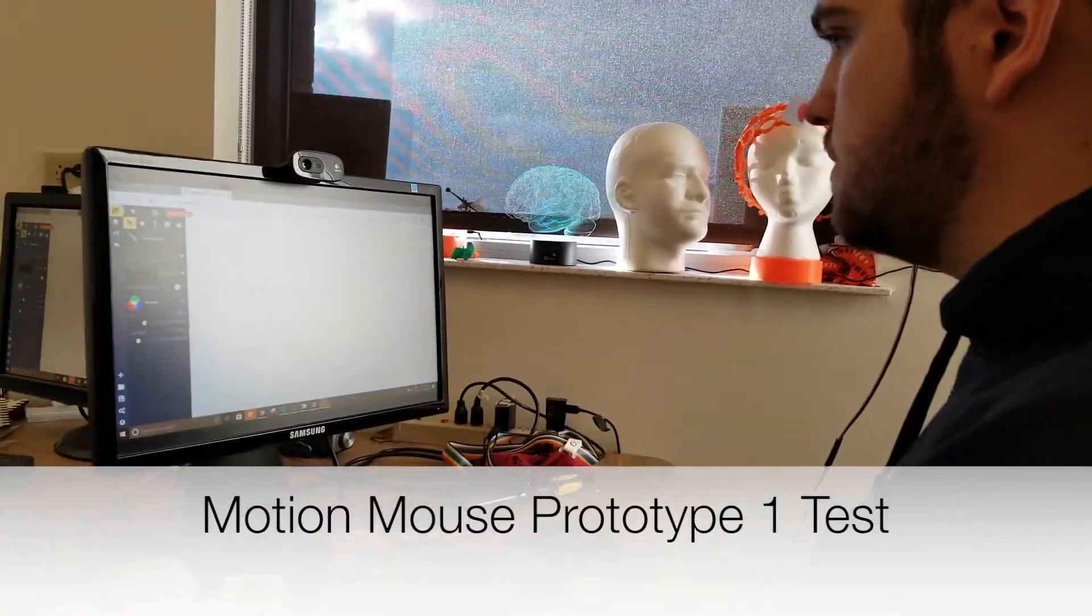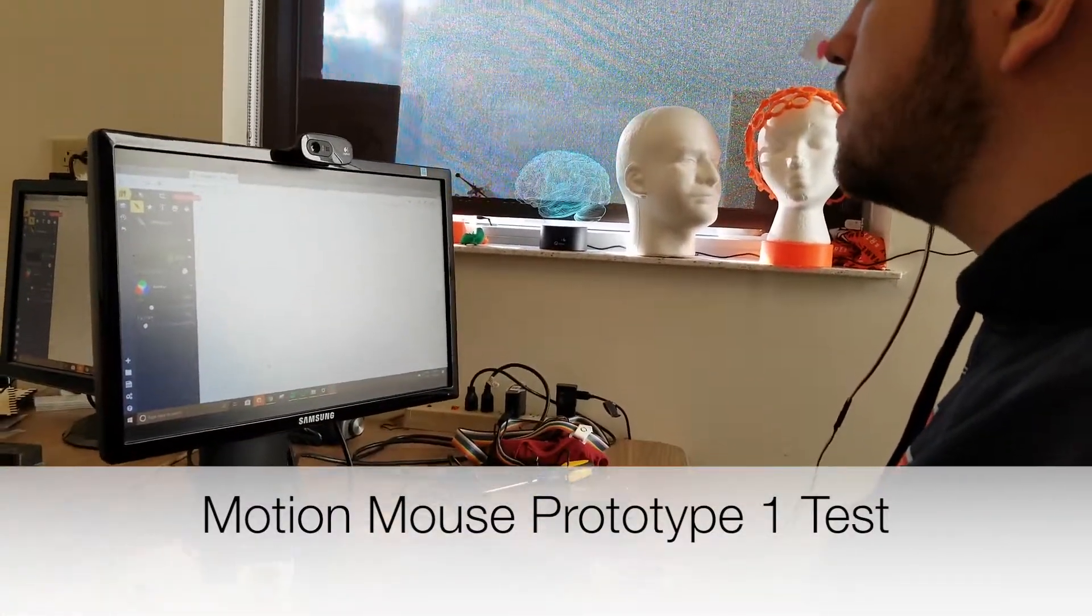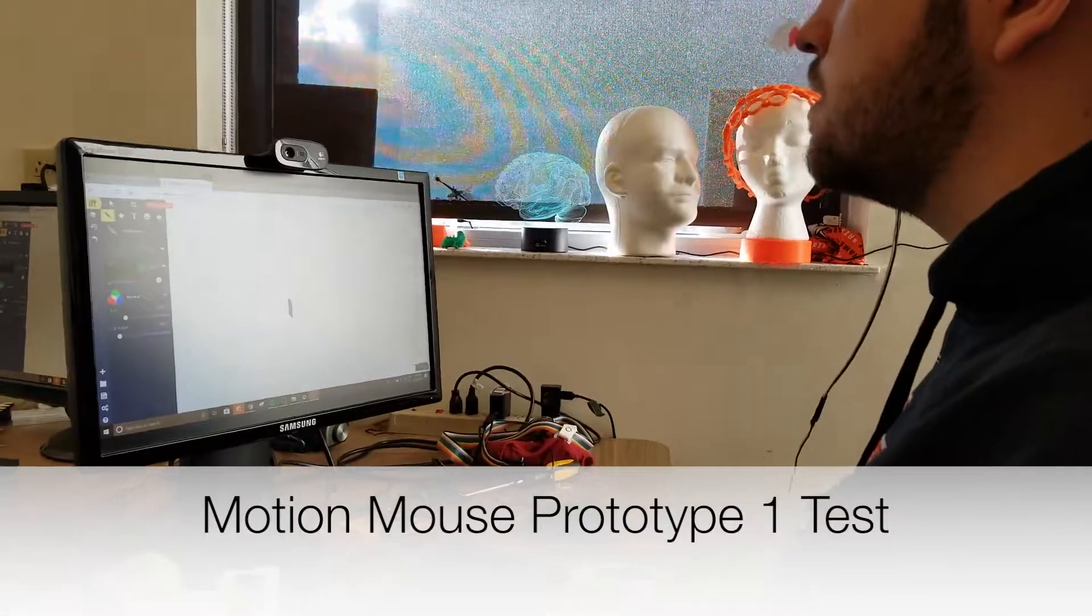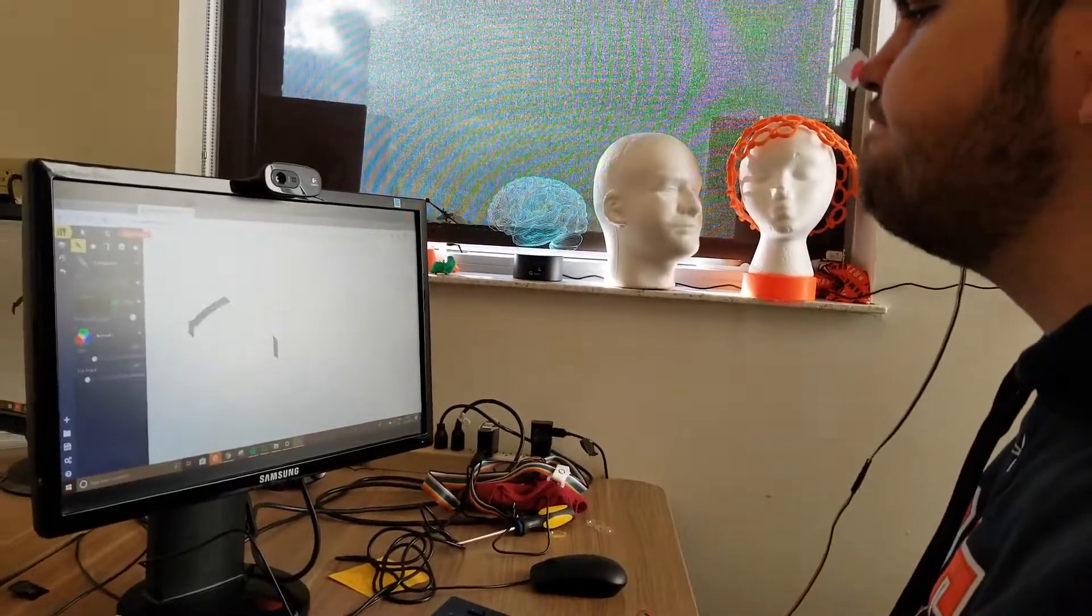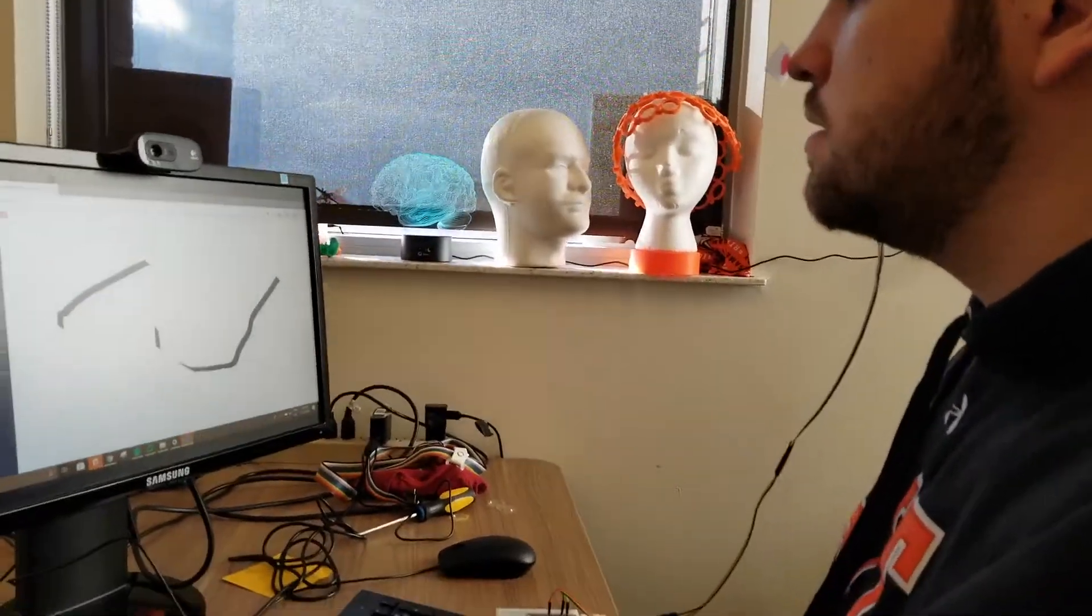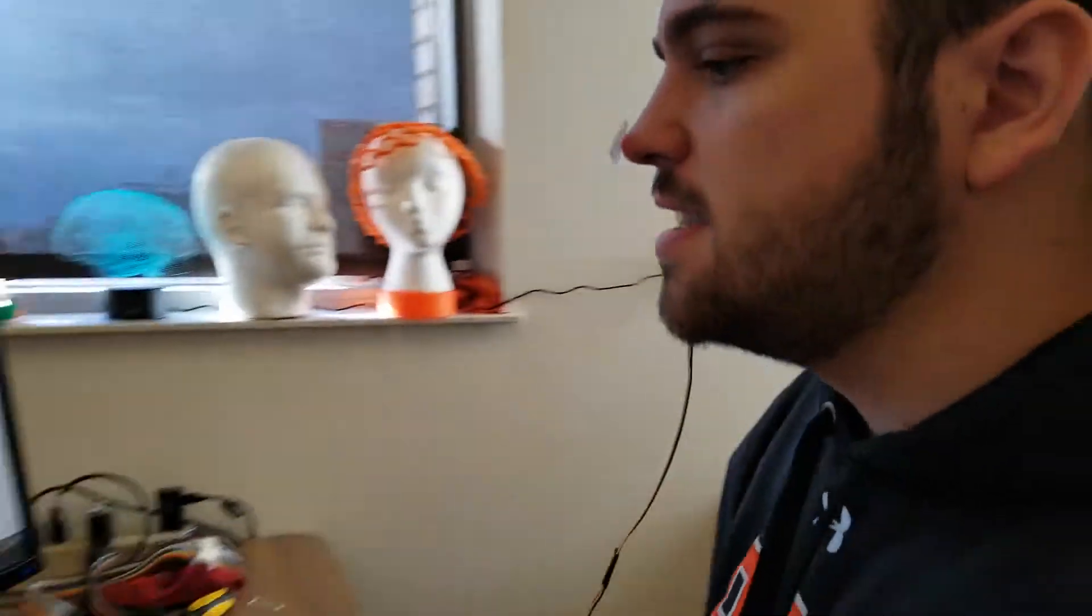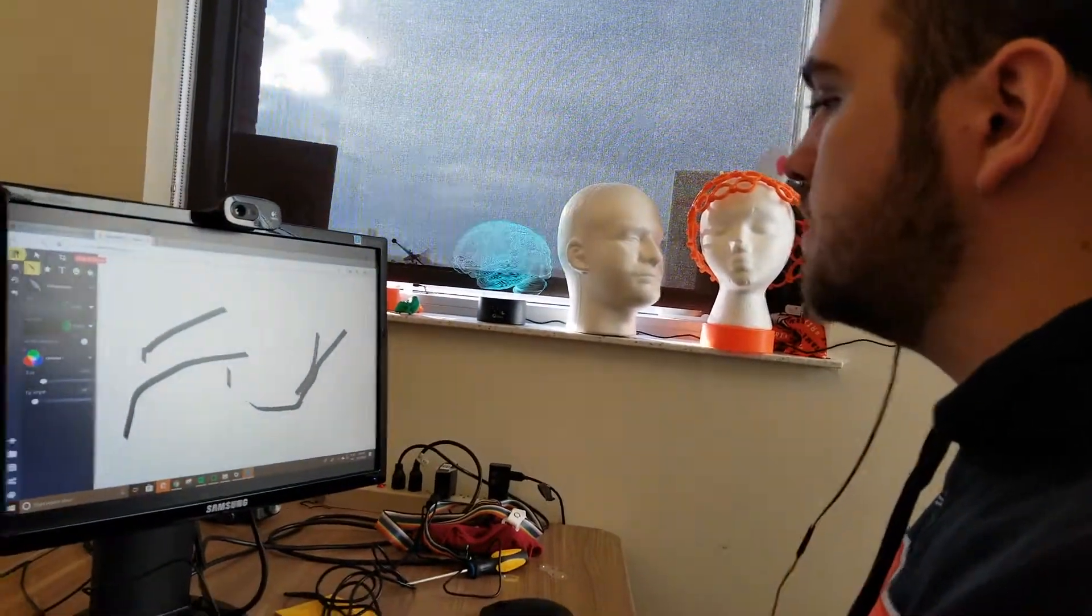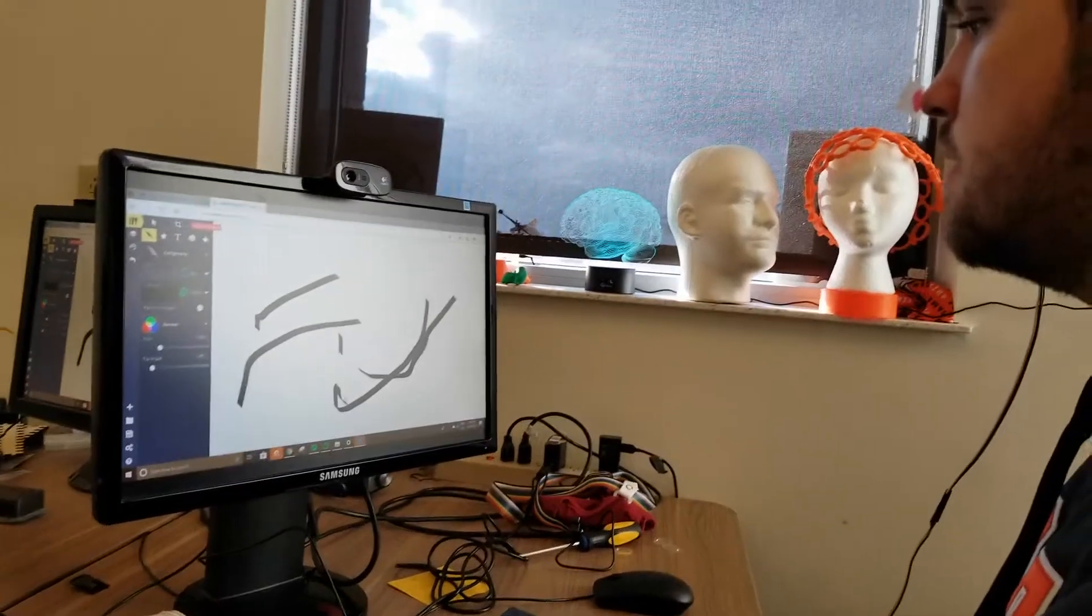So we have Colin Fosnott hooked up with our new mouse motion control. The webcam, you can use any webcam for this, is tracking this red dot on Colin's nose and seeing which direction he moves it to move the mouse around the screen.